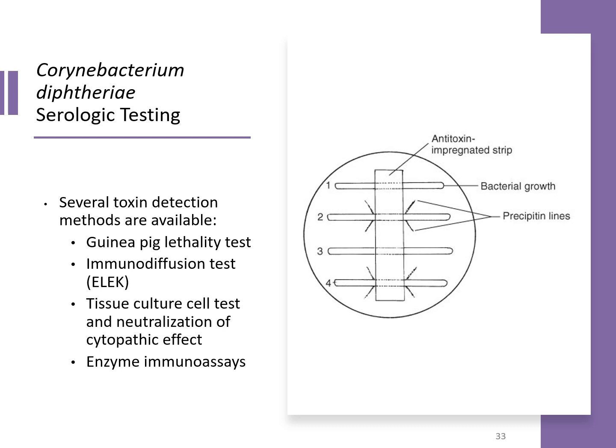And then you have your serological testing, in which you're looking for those different toxins where that organism is streaked onto that plate, and then you have an antitoxin strip that's laid onto it. And depending on that bacterial growth, so you have your bacteria growth here, you'd streak a line across, and you would do that several times, lay that strip down, and what you're looking for is these little precipitation lines to help you determine the particular toxin.